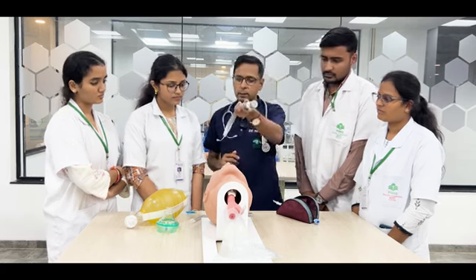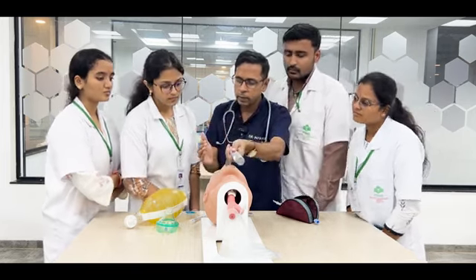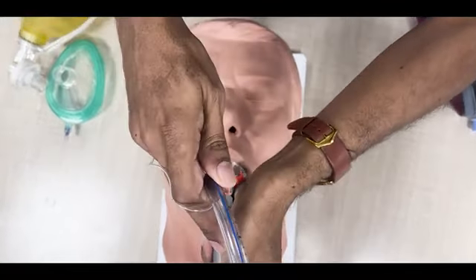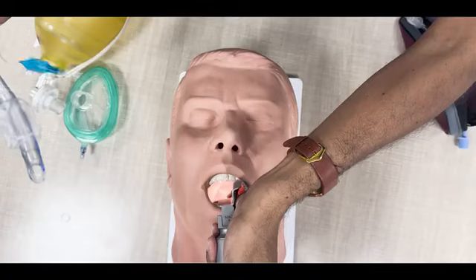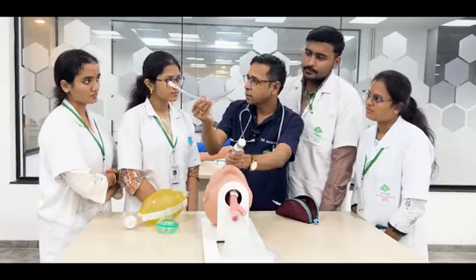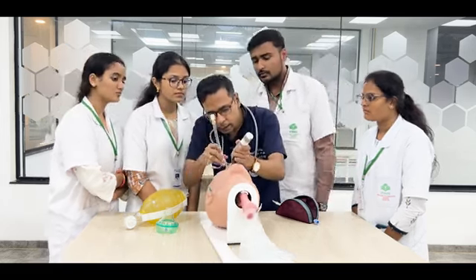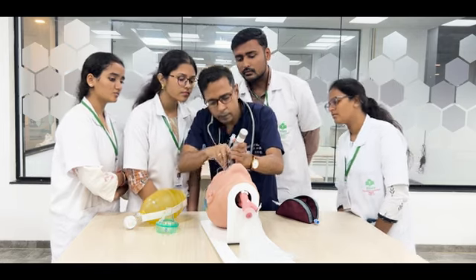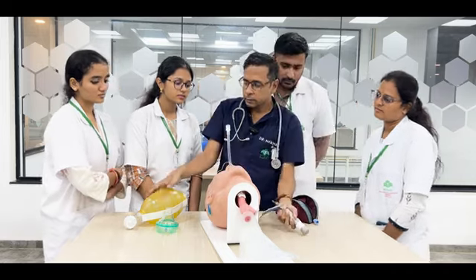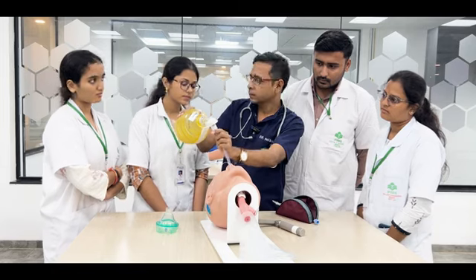Once I see that the laryngoscope is working, from the right side of the patient, I will introduce the laryngoscope, and once I enter the oropharynx, I'll just give it a 45 degrees pressure. I'll slightly lift it. I'll take this endotracheal tube and introduce it inside, and that's it. The patient is intubated. I'll attach this bag mask, and I'll see that the lungs are inflated. That's it.